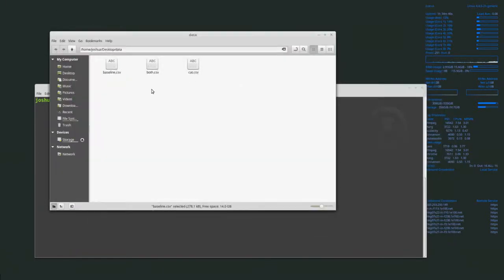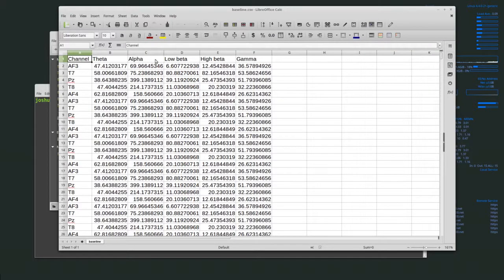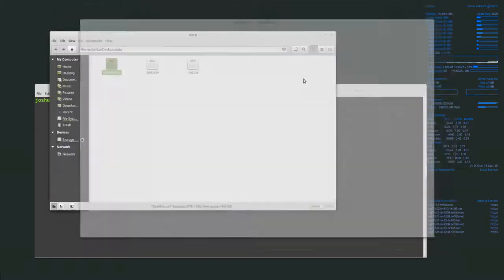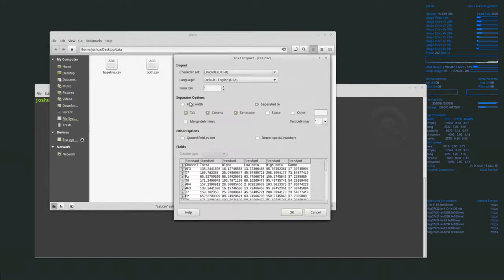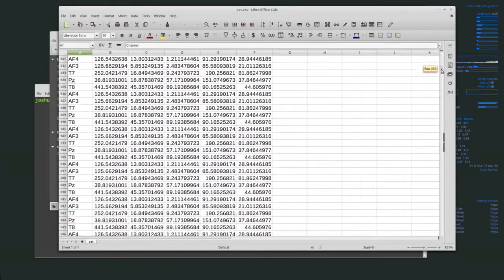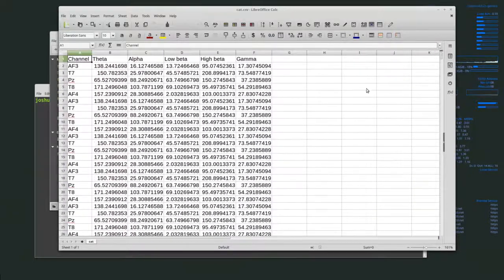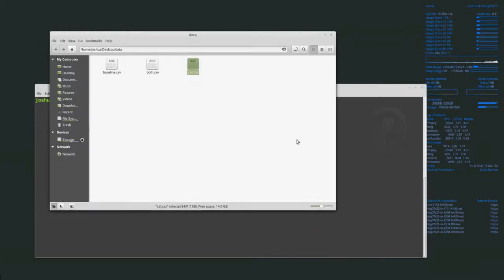We have these two files — baseline.csv and cat.csv — in the same format: channel, theta, alpha, low beta, high beta, gamma. We've recorded this over time, so we have all of these entries across all channels. The sample rate was every second or so — a measurement every few seconds for these different values.